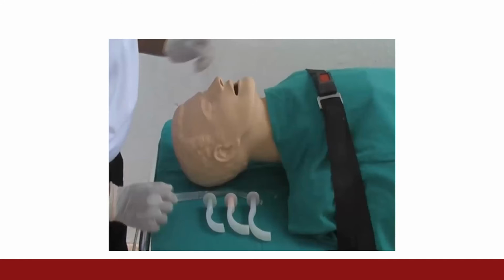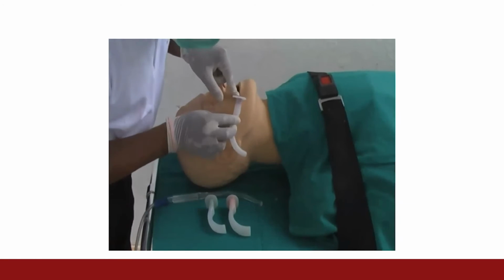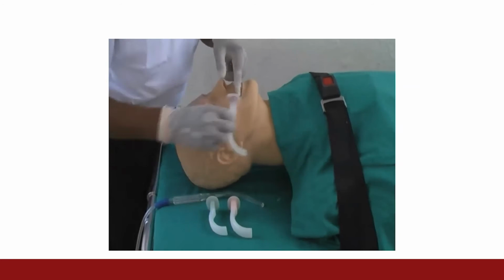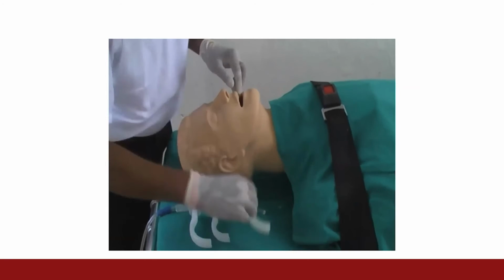Here's a video showing a provider going through the entire process of sizing and placing an oropharyngeal airway. The provider first attempts to size the airway. Both the first and second airways he chooses are too long as they span past the angle of the mandible.